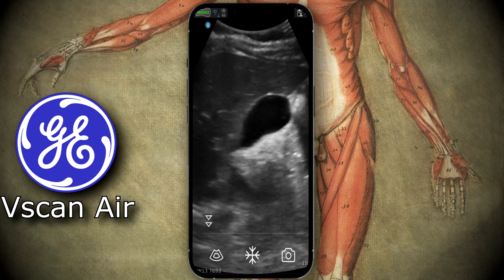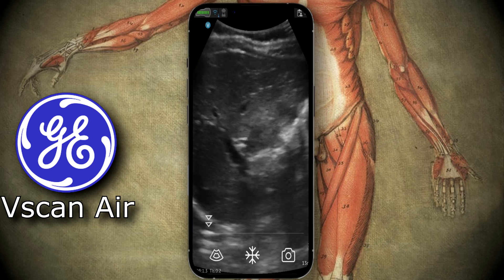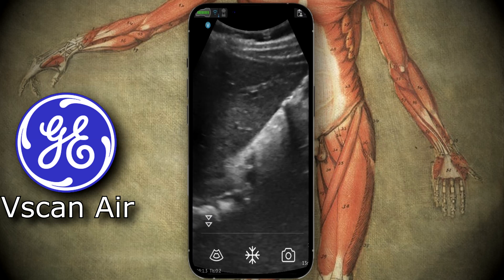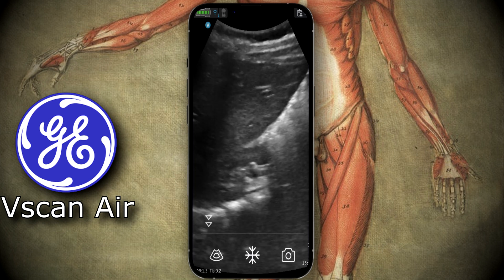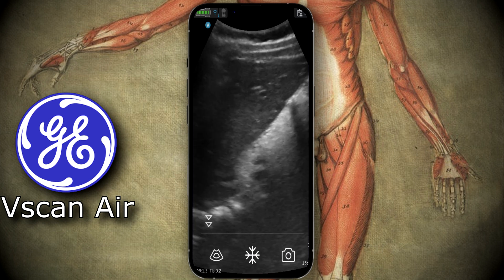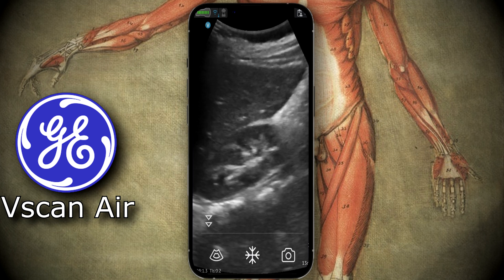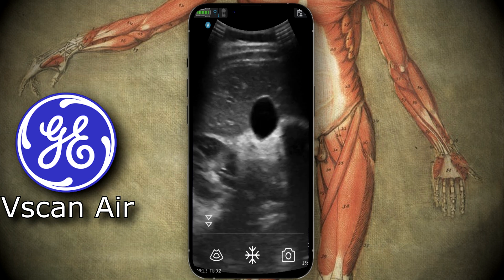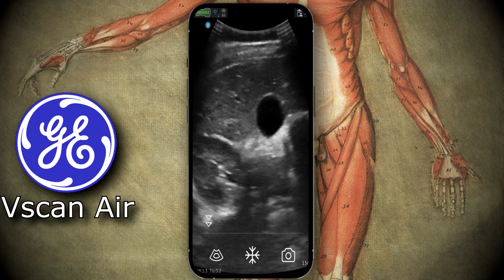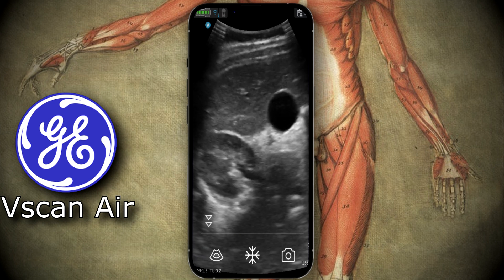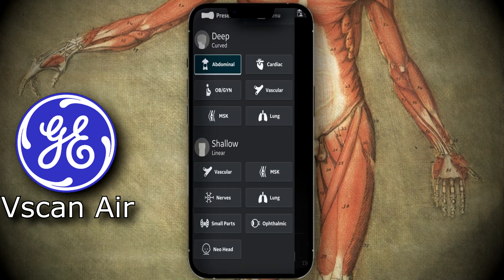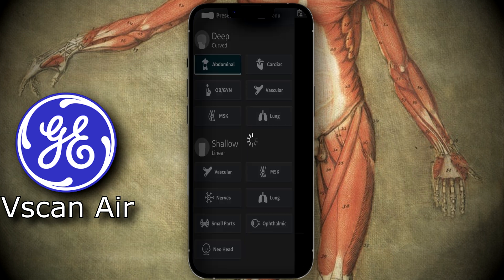Here we have a case for appendicitis. I begin in the right upper quadrant — you can see the gallbladder very clearly, then we go into the right liver and kidney interface. Transverse gallbladder, liver, kidney — very clear. No free fluid in Morrison's pouch, no gallstones. Now switching to the linear probe.